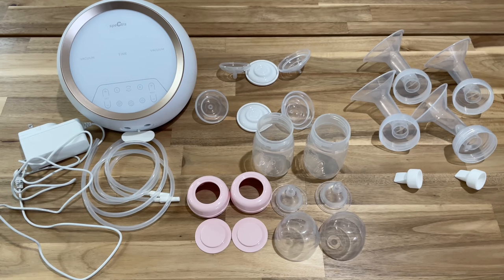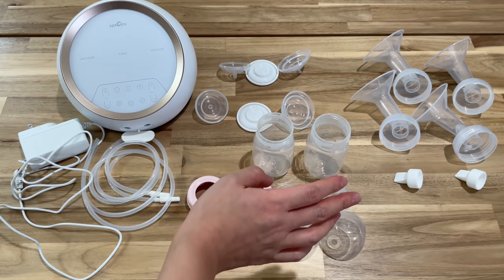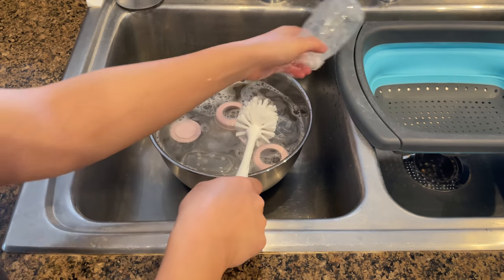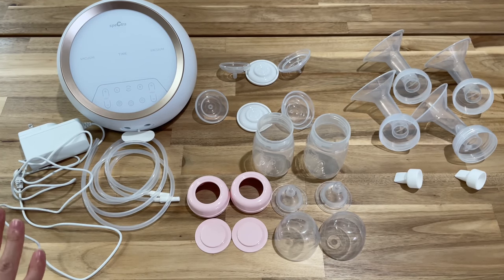I'll be taking over on instructing the step-by-step on how to set up this pump. Before I get started, it's important that the pump parts get washed. The pump parts include everything you see on the right: bottle parts, the flanges, the duck bill, and the backflow protector. Those need to be washed and sanitized because they come in contact with milk. You don't need to wash the pump itself, the tubing, or the adapter. The tubing definitely should not be washed or sanitized because it never comes in contact with breast milk, since these are closed system pumps.